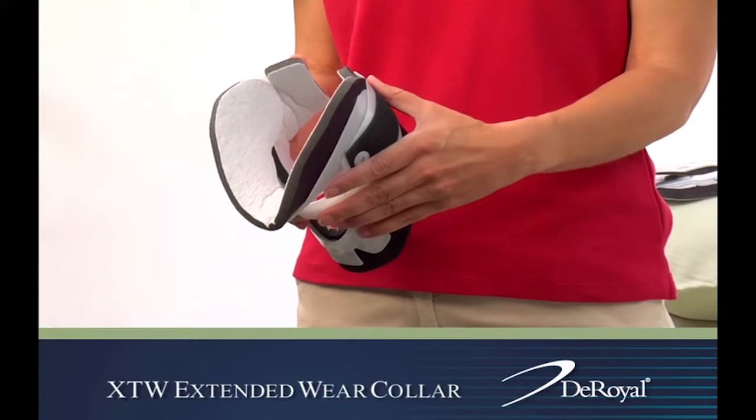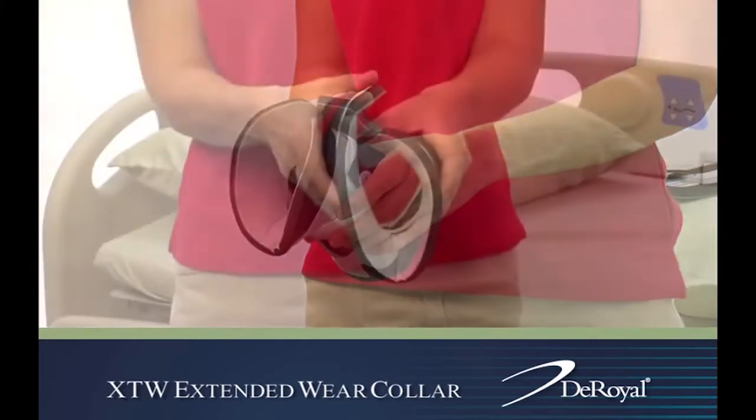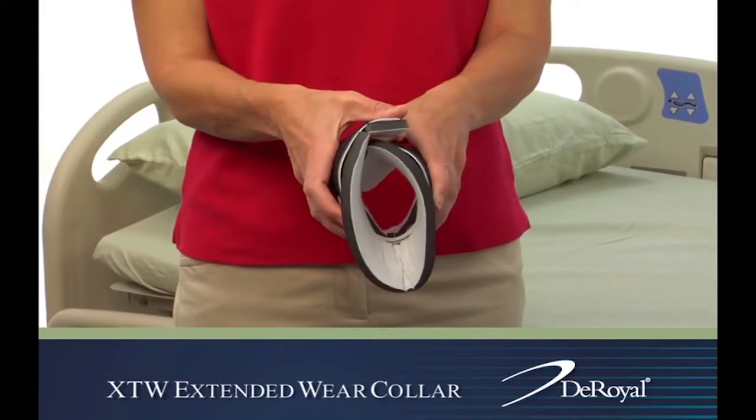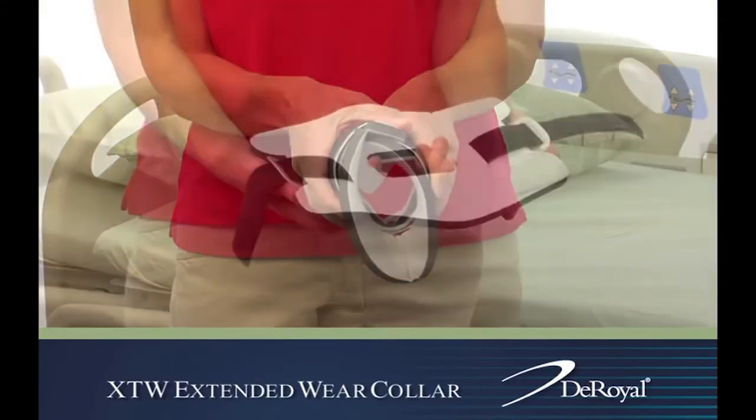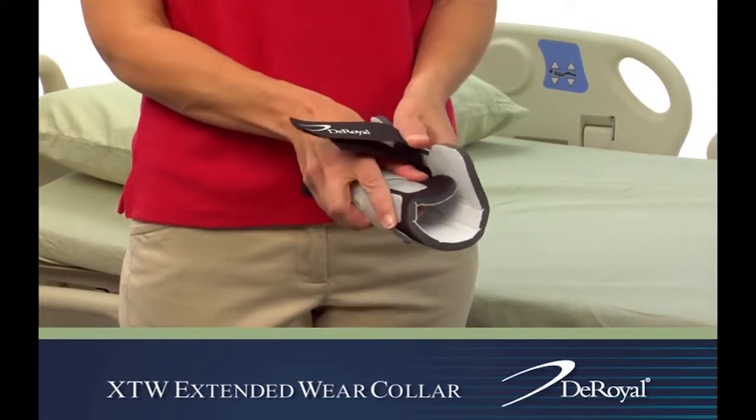Preform the collar prior to fitting. To preform the front panel, roll the panel sides inward with both hands. To preform the back panel, roll the panel into a cylinder.